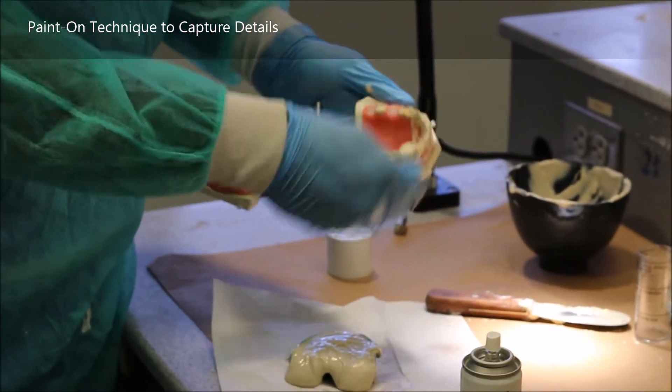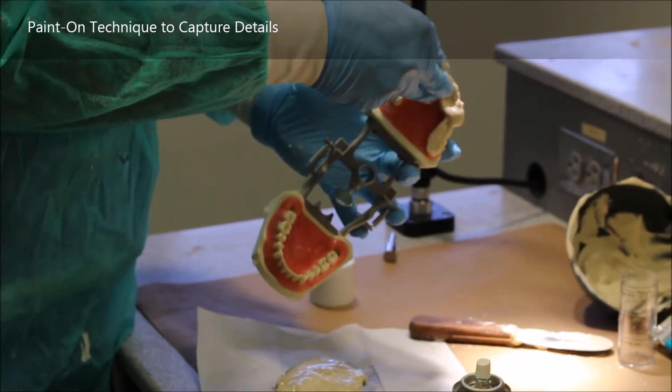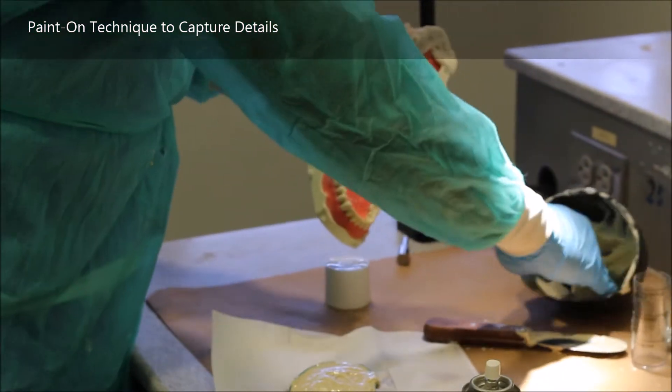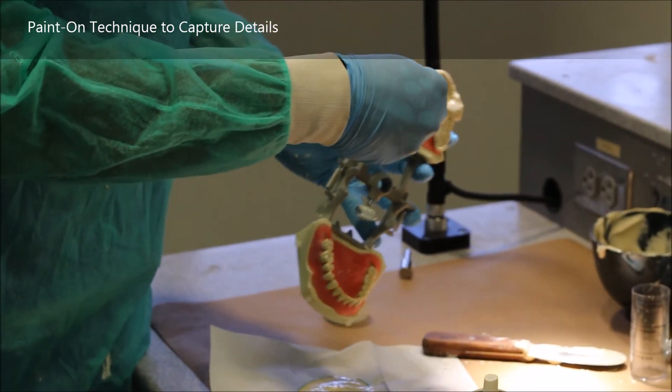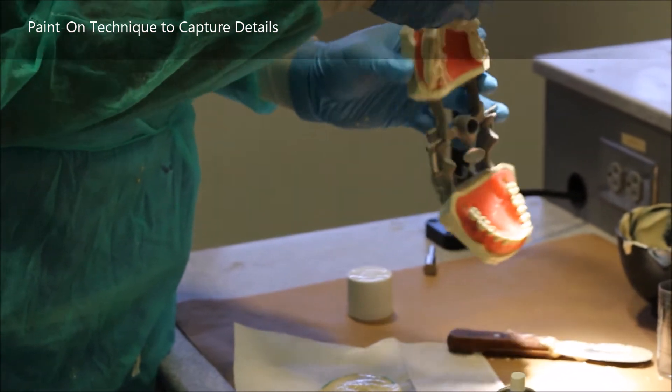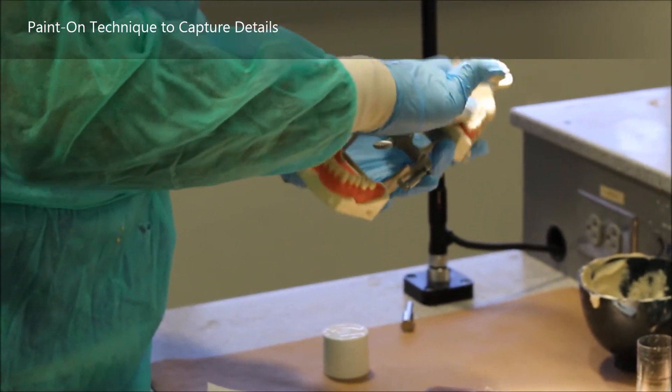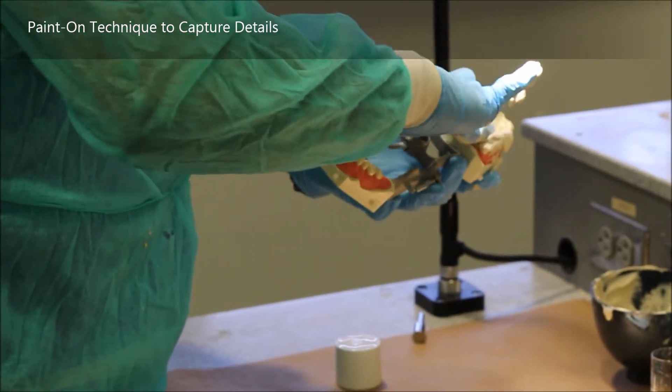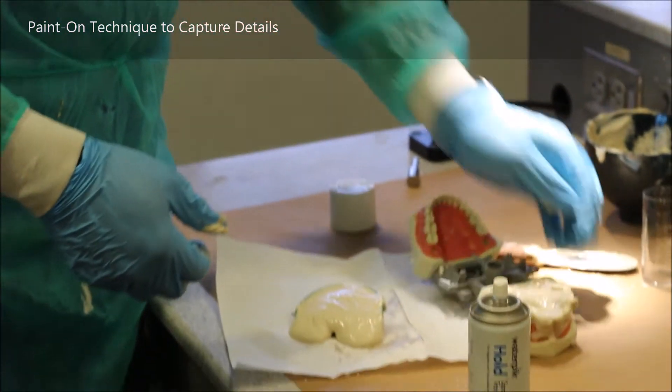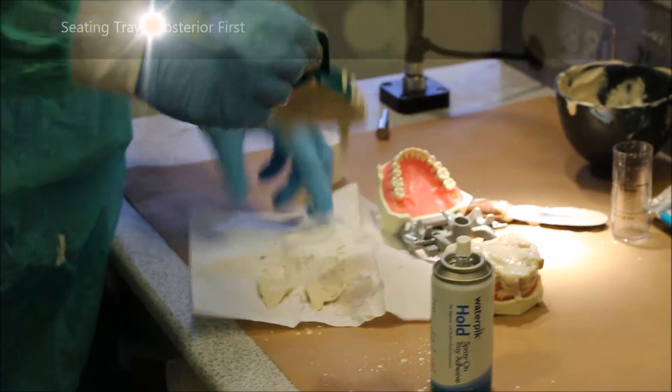Grab some impression material amongst your fingers and rub it as hard and as forcefully as you can on the occlusal surfaces and through the embrasures. I'm quite literally taking fingers full of alginate and pressing it on. I also take a little bit of alginate to cover the palatal area because that can be somewhat difficult to capture on a typodont.